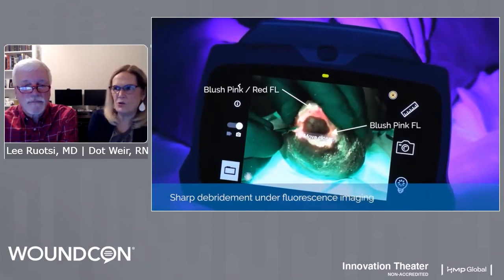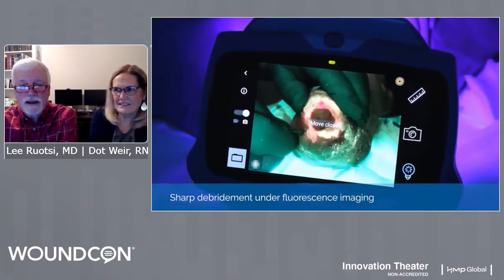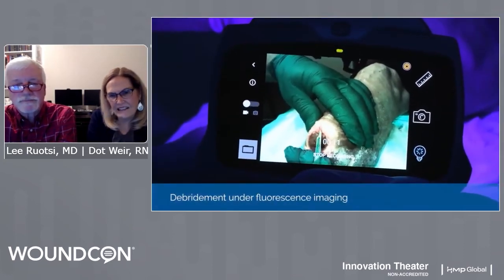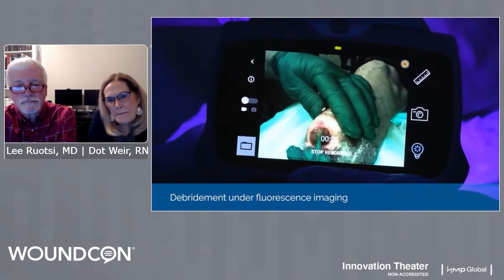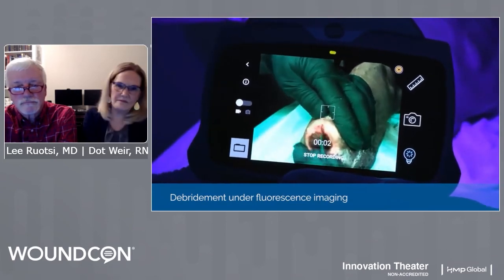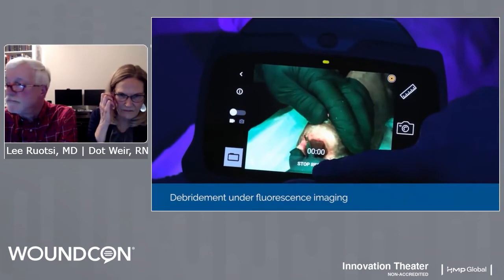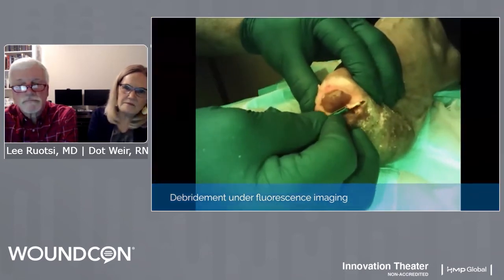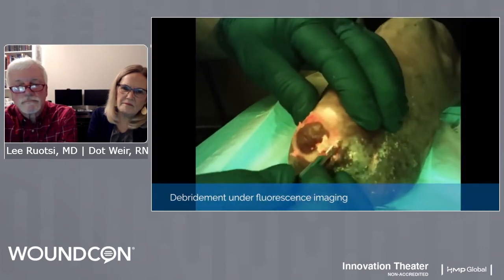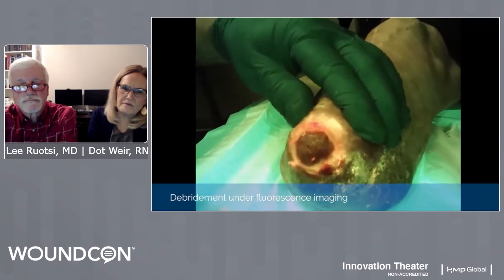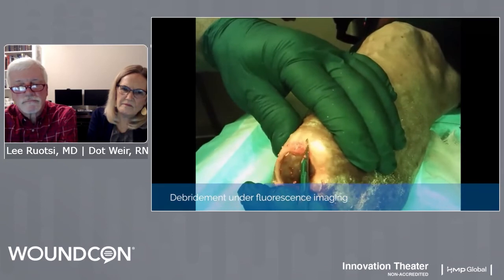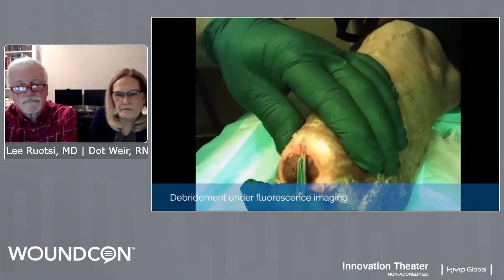This is a great illustration of the fact that peri-wound callus tends to be even more saturated with bacteria than macerated tissue or plain skin — callus is just like a sponge; it just soaks it in. Most of what we identified as fluorescing bacteria before we started is now pretty well gone. I'm wondering whether the area at the 12 o'clock position is bright granulation tissue showing up because of the light — no, that was bacteria; we can flick it off.